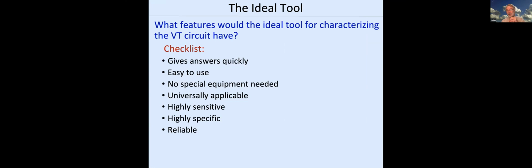But that's not the tool I want. I don't think that's the very best tool. The tool I want is this tool. This is a mega catheter here. You see all these electrodes. There's about 400 electrodes, maybe 1,000, I don't know. Each can stimulate and each can cool the tissue very quickly.